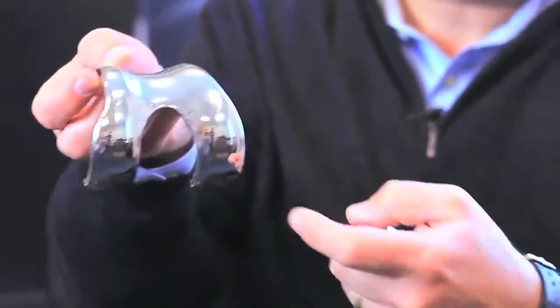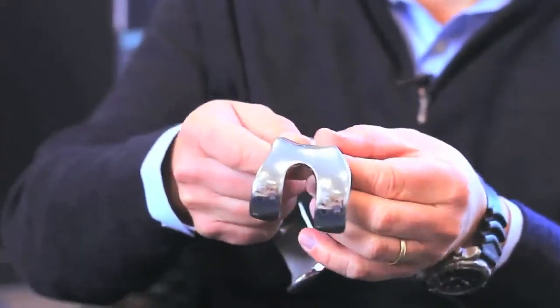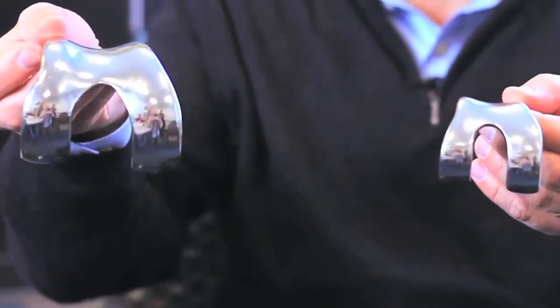The principal thought behind all of this was we want to correct any underlying deformity, bowlegs, knock-knees, so we go back to normal mechanical alignment of the joint. But then we want to recreate the anatomy that the patient had prior to developing arthritis. The hypothesis was, rather than taking a fixed symmetric shape with constant radii, well, no human knee has constant curvatures or constant radii, every patient is different. If we can go back and recreate something close to the patient's original anatomy, corrected for deformity, we should get a much better clinical result, we should get a much better functional result.